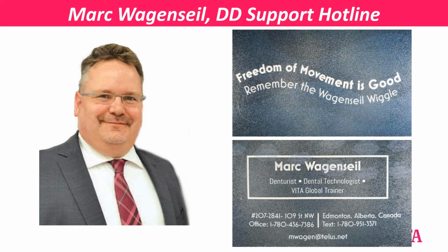Okay, so number one is the sizing. I use Lingoform on everything. They come in different posterior sizes. So you try to match, number one, the size to what you think is necessary for the arch size. And then if I'm ever going to drop a tooth, I will drop a second premolar versus a first or second molar.